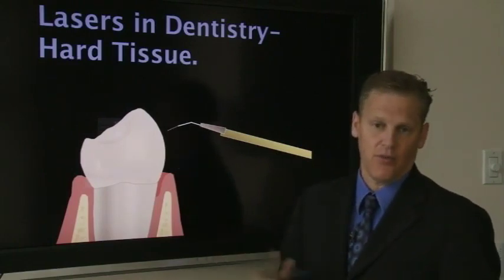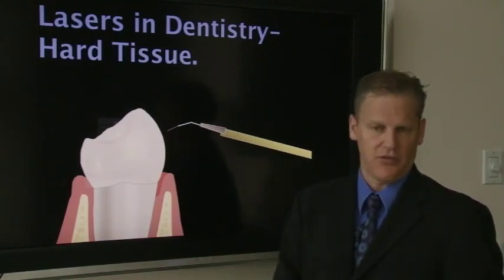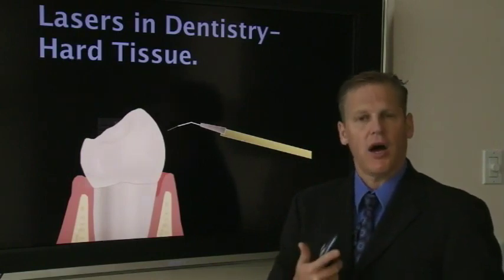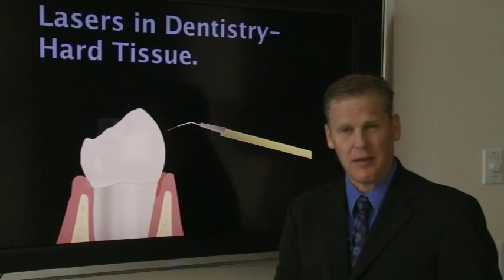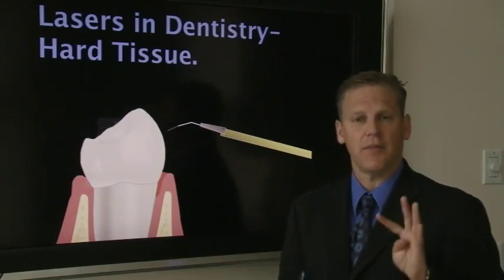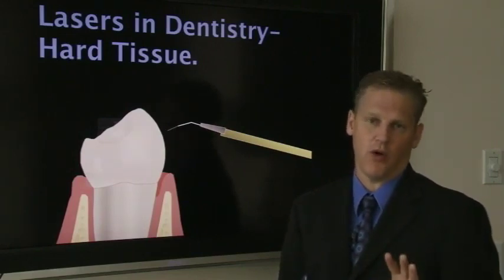All areas of tissue have water. Soft tissue has 90% water. Enamel has 6 to 10% water. Dentin a little higher, and caries is a little bit higher than that. So you'll find that because of that, all tissue has water in it.